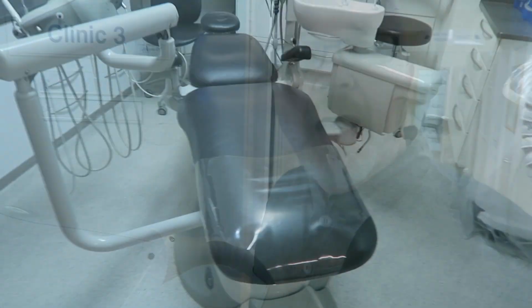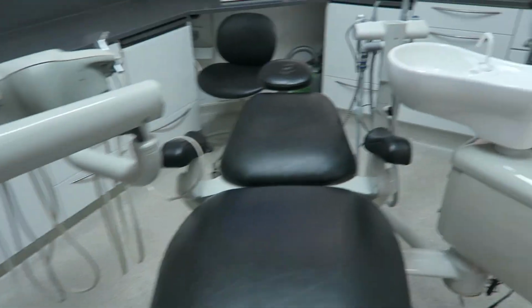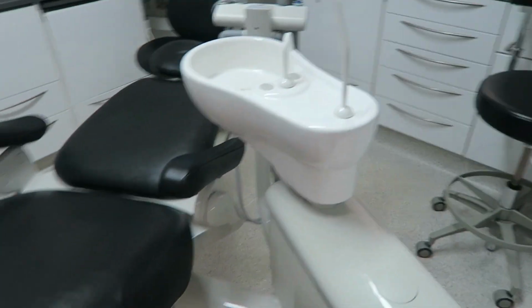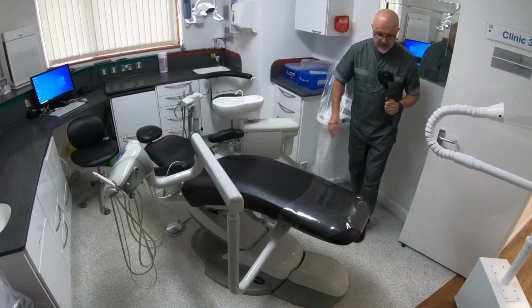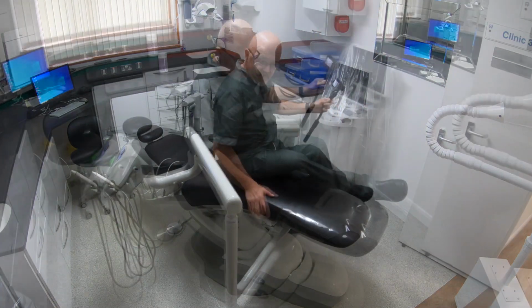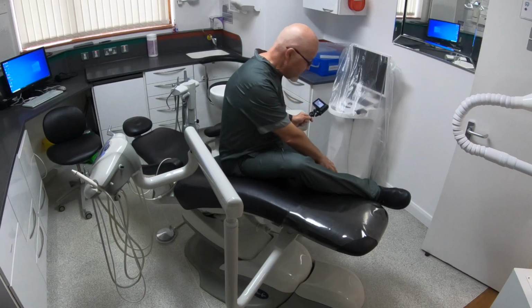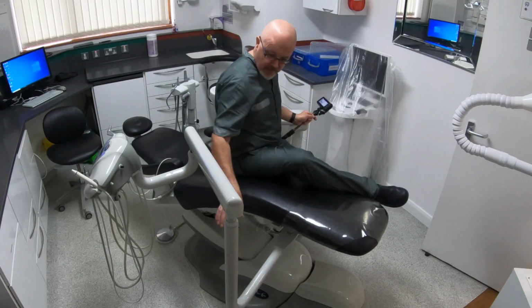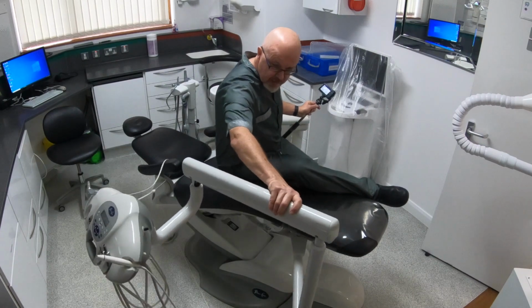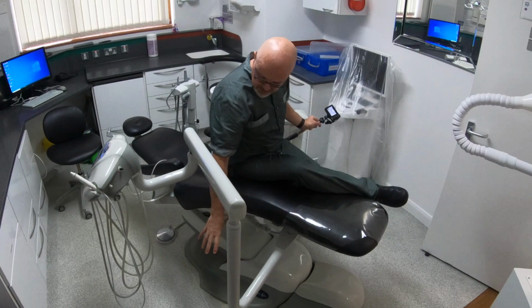Right, okay, so coming into my third surgery with the DentalAir. In this room, the patient entry is from the right-hand side here, so the spittoon has to be moved over, and then the patient gets in like so. Obviously that means that we can't place the DentalAir or the VacStation in this area here, and on this side with the delivery arm swinging in and out like so, it makes it challenging to put it here.